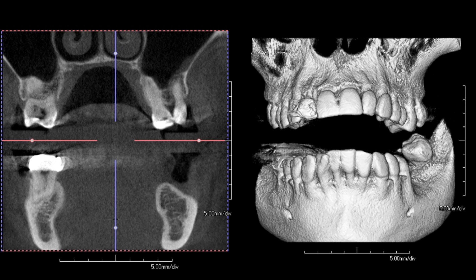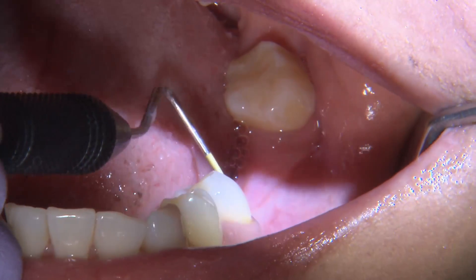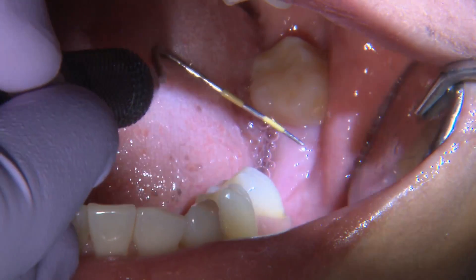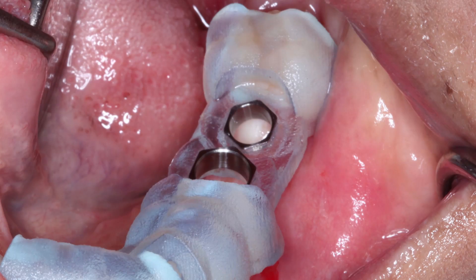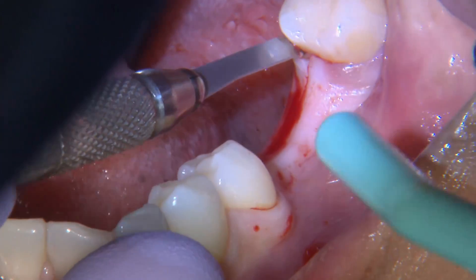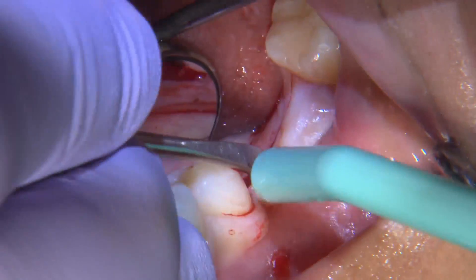We looked at both and came up with a treatment plan to place implants utilizing guided surgery. However, there's a twist — we reflected a flap before placing the implants. I wanted to reflect a full thickness flap to be able to visualize the bone and evaluate. One of the main reasons for reflecting the flap is to help create more keratinized tissue on the buccal surrounding the implants.